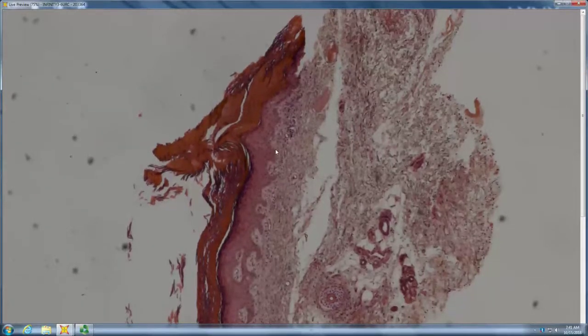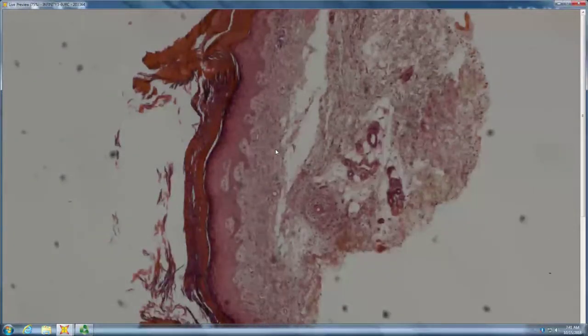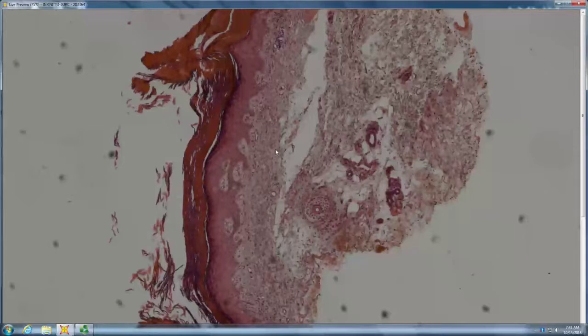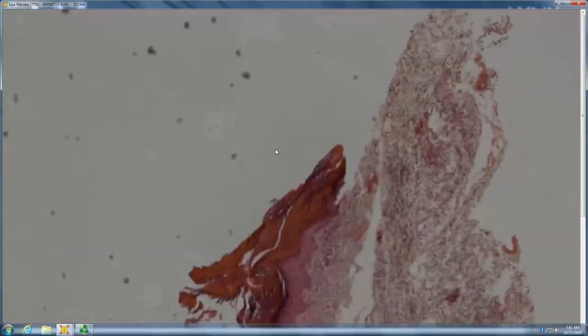No, go ahead. You got the same bug I have. Is it cornoid lamellae? Yeah, cornoid lamellae. Porokeratosis? So porokeratosis, and these are multiple all over the legs. And so the clinical sounds like DSAP, disseminated superficial actinic porokeratosis.